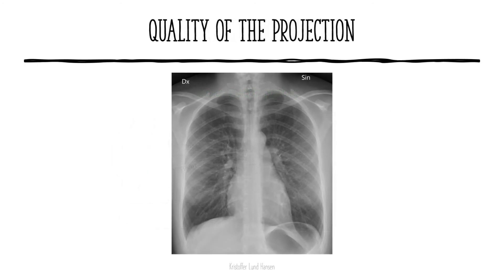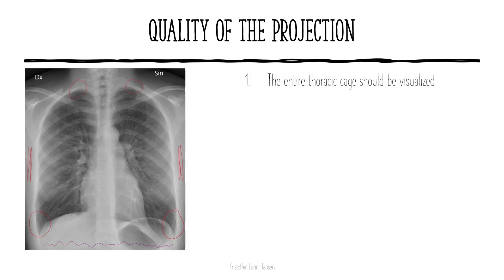Then we have to assess the quality of the projection. The first thing we do is to see if we have the entire thoracic cage visualized. To see the entire thoracic cage, we have to see both the sinuses at the bottom, also called the costophrenic angles, and the first ribs at the top and some of the soft tissues on the side. We don't want to see too much of the abdomen — only a small part at the bottom — as too much abdomen means we see less of the lungs and can overlook important pathological changes.